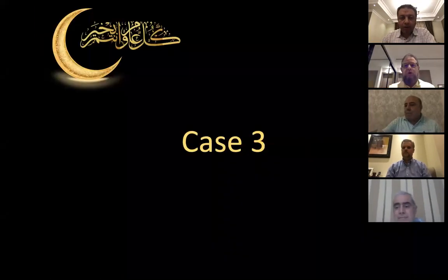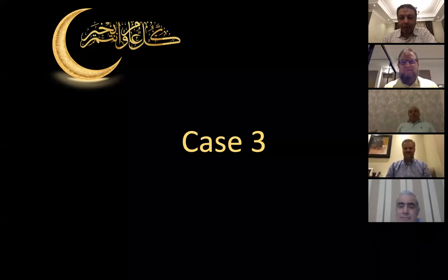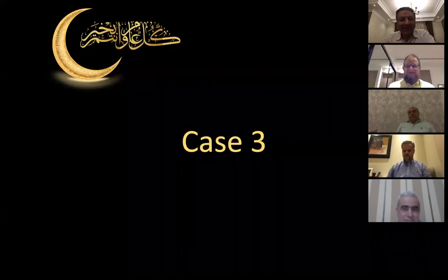So we can move to case number 3. But there is a question here finally about the angle kappa. You talked about the high order aberrations in the premium area. What about the angle kappa? I want to cover both in the laser based case, case number 3. About angle kappa, okay, great.